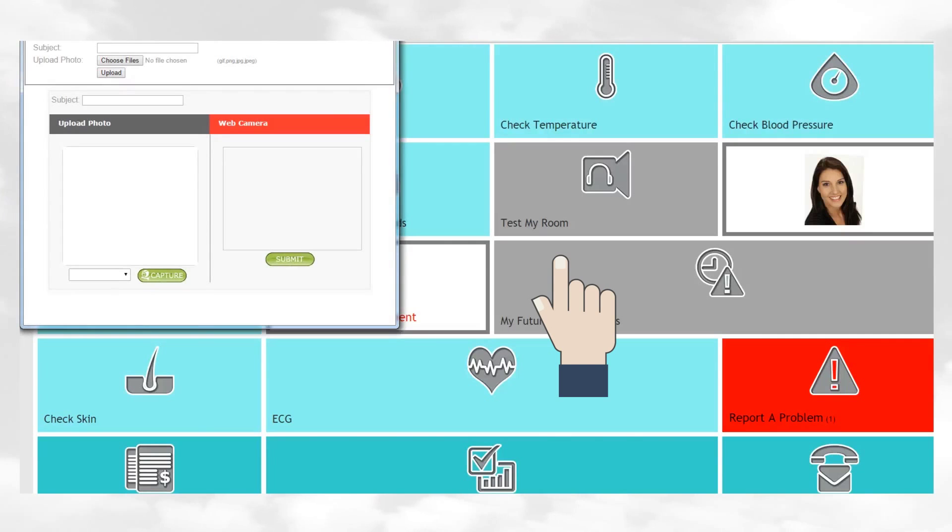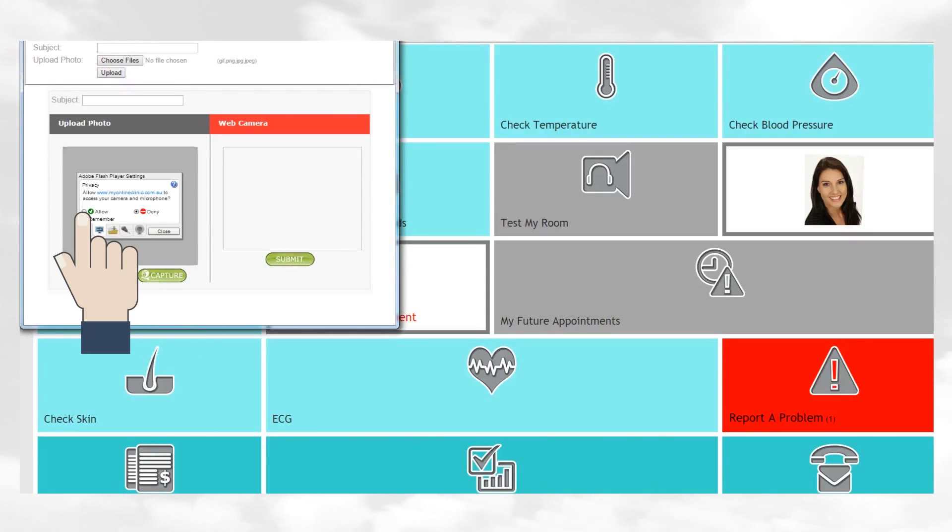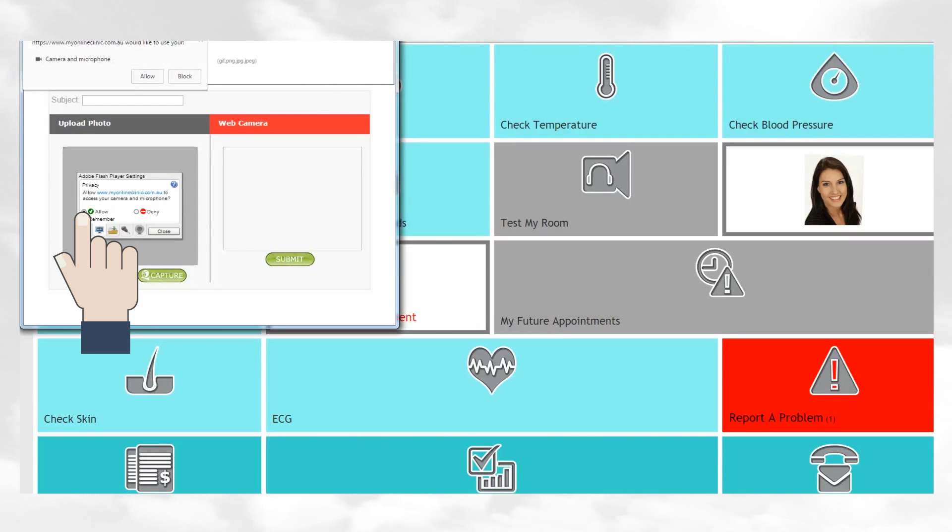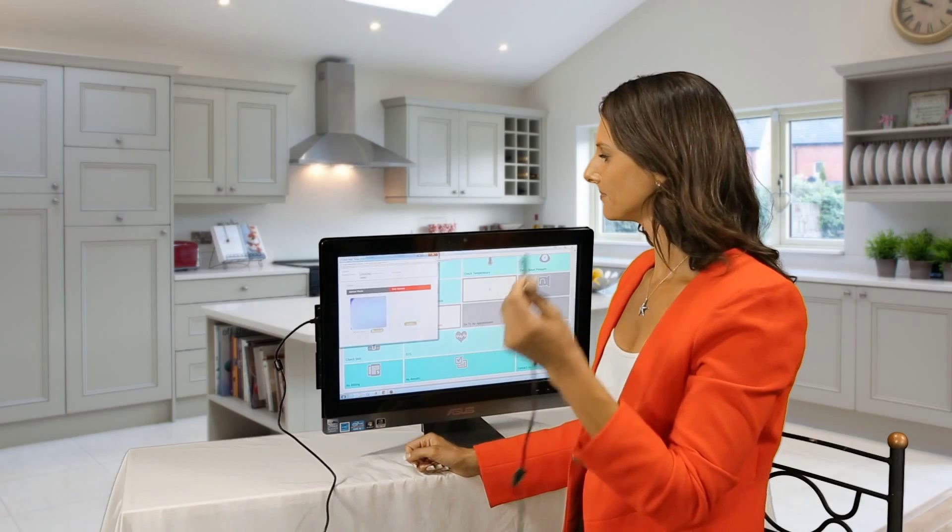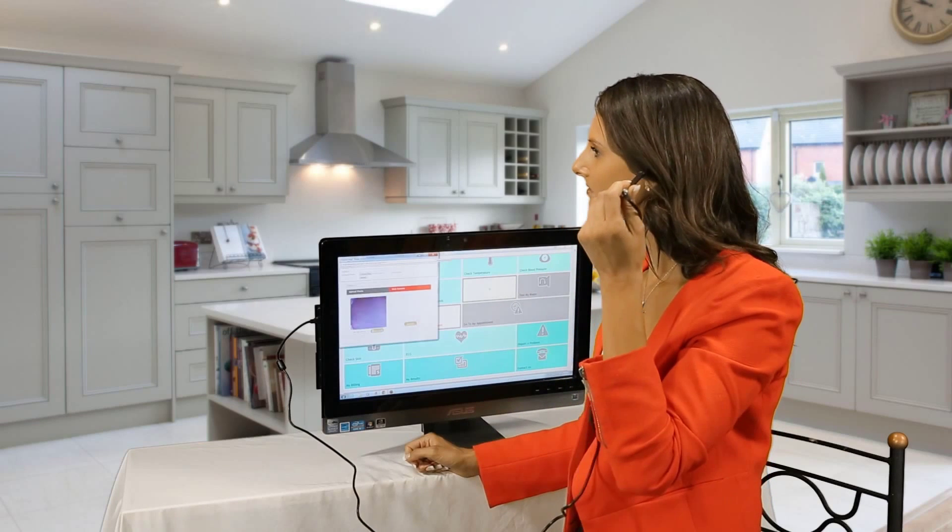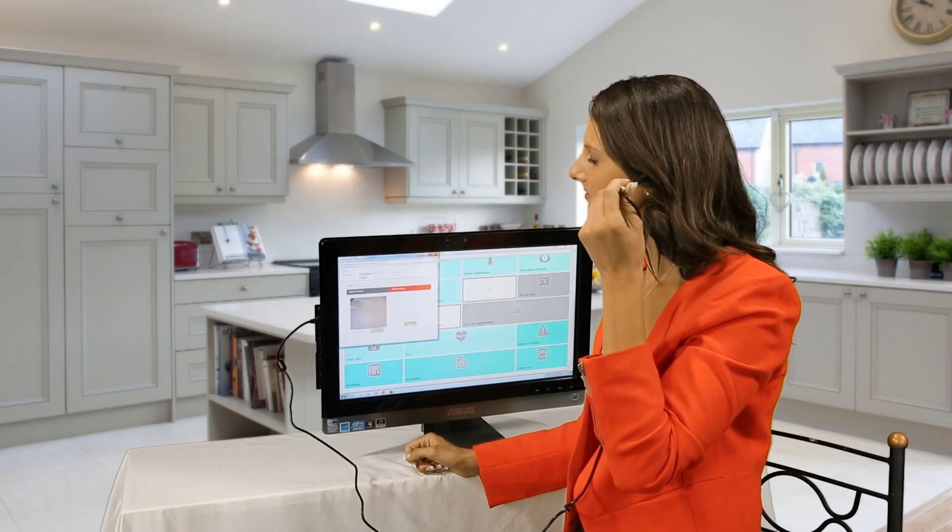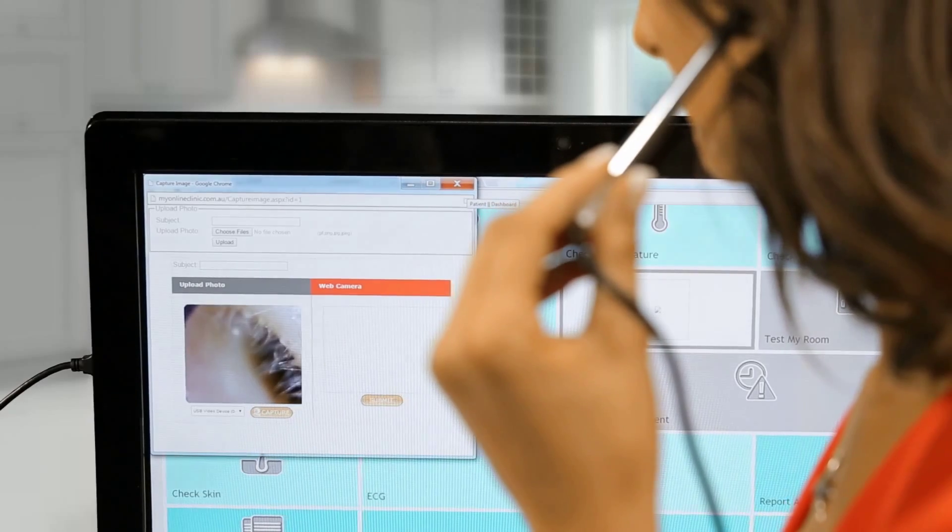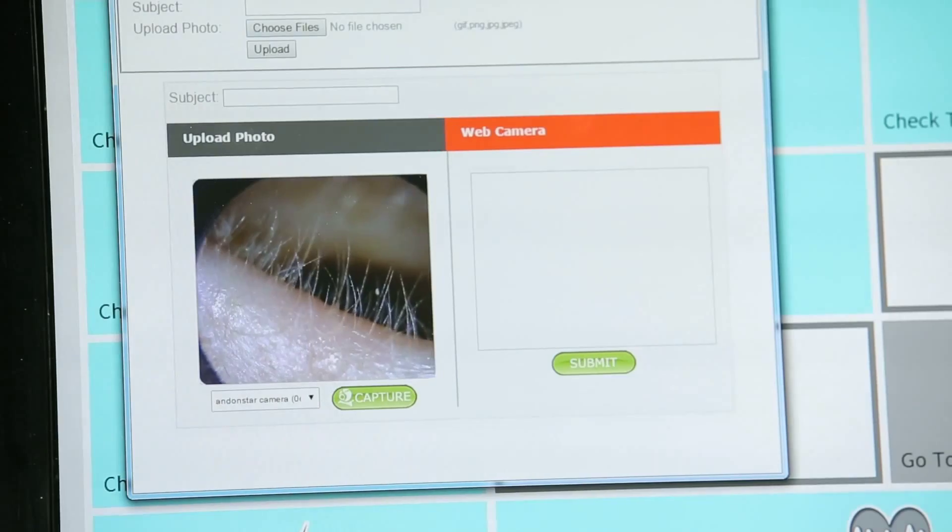First, click on Allow for permission from My Online Clinic to access the camera device. Put a probe cover on the device. Insert the probe very gently into the ear.